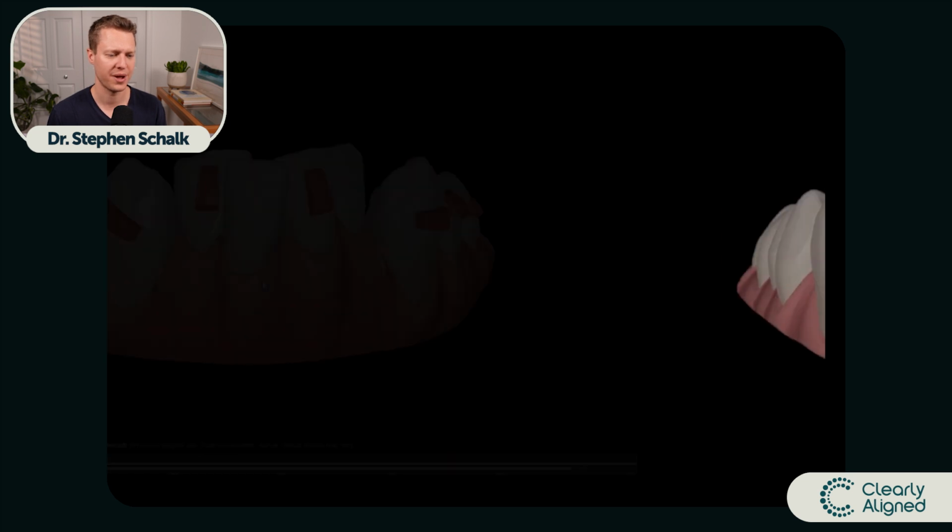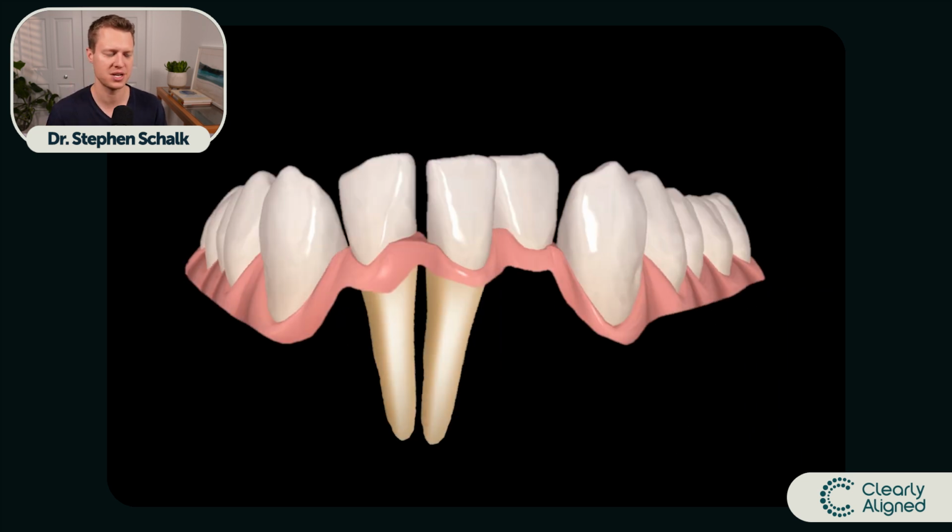Let's go ahead and actually show it. So what does this look like? Well, let me jump in first here. Let's jump in and take a look.